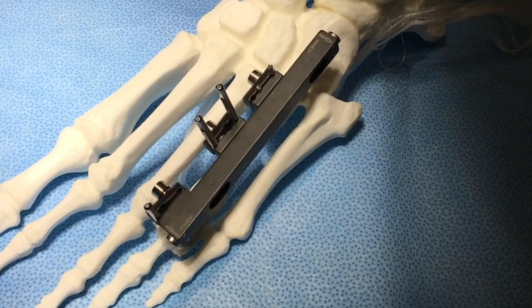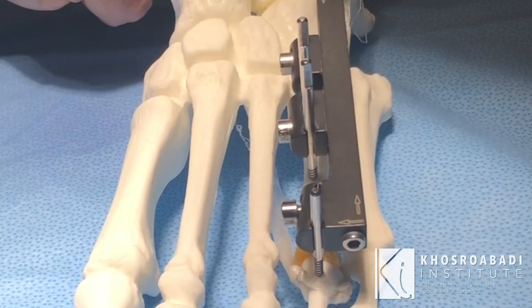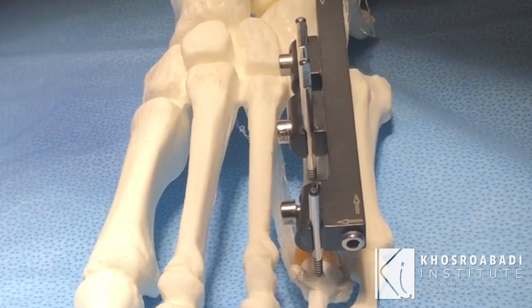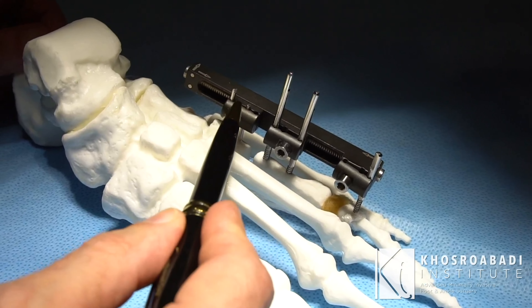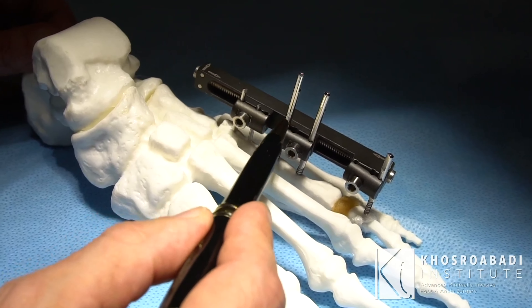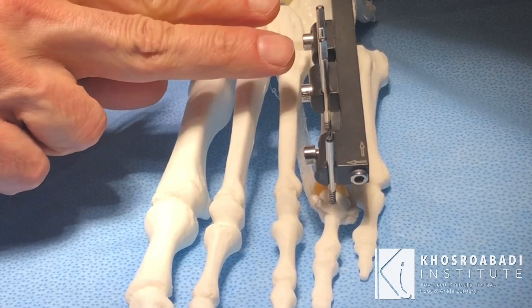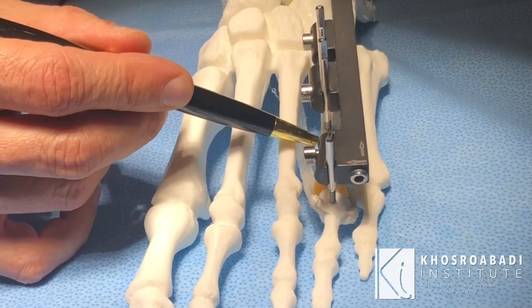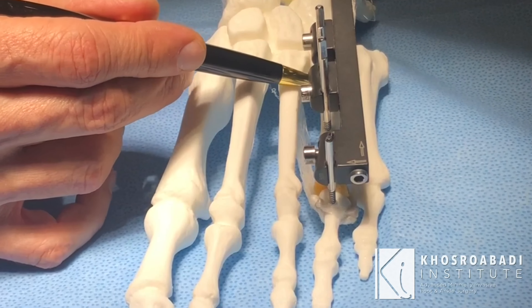For the purpose of this video, we're demonstrating a new construct of external fixation for metatarsal lengthening. This new construct has three sandwich clamps — two of them are responsible for lengthening the metatarsal, starting to separate from each other and adding length to the metatarsal, which is the basis for brachymetatarsia.